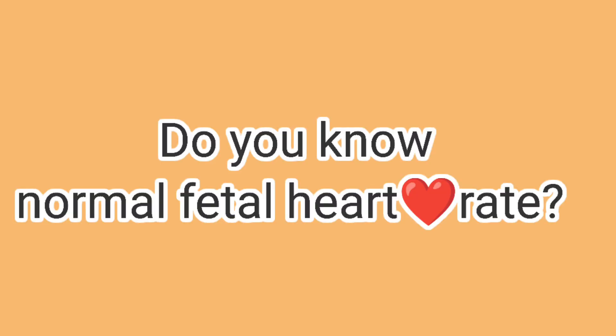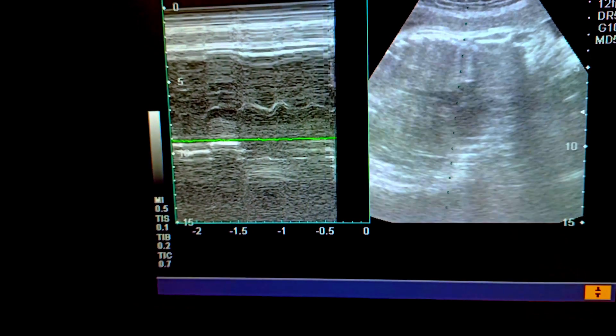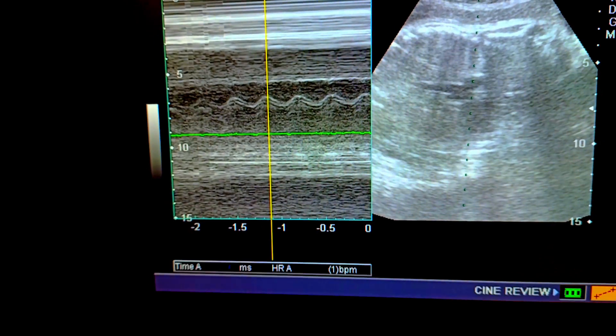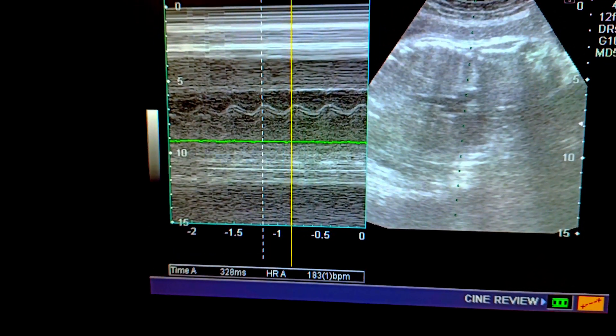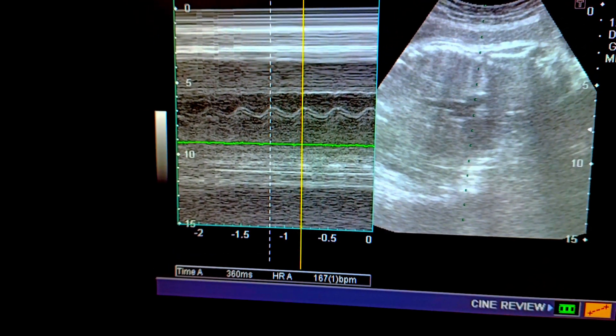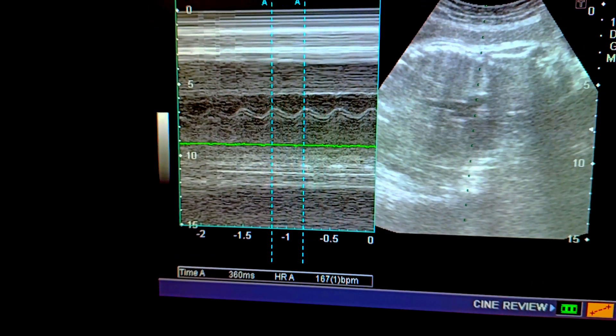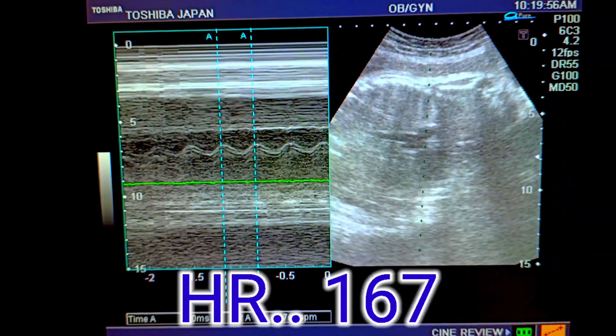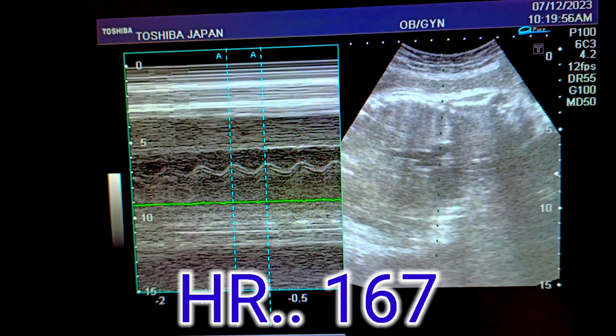Do you know the normal heart rate, and is it important to find out the heart rate? We would like to find out the heart rate in this particular patient — the fetal heart rate is about 167 per minute.